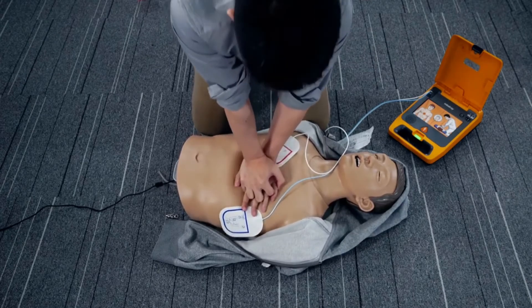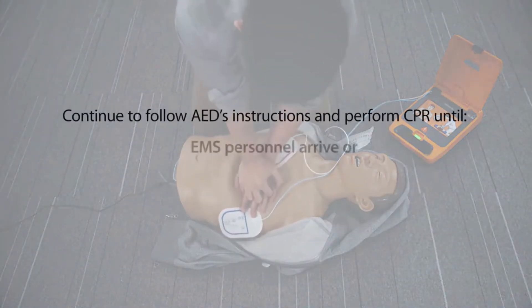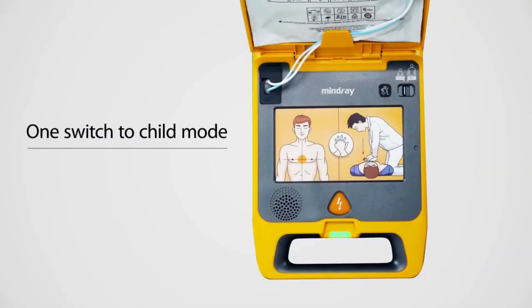Give chest compressions immediately. Child mode.